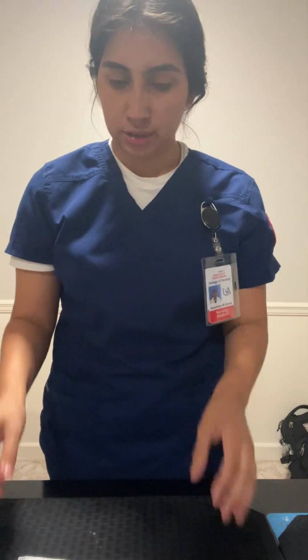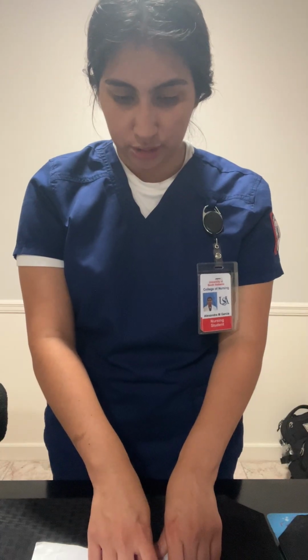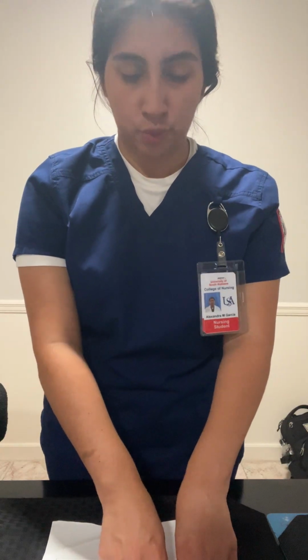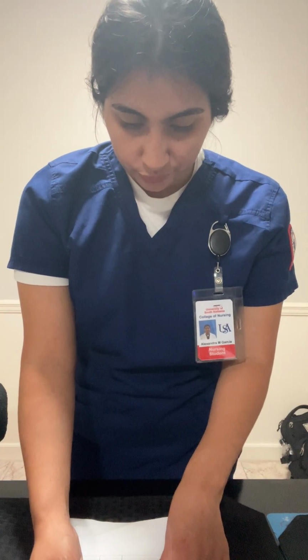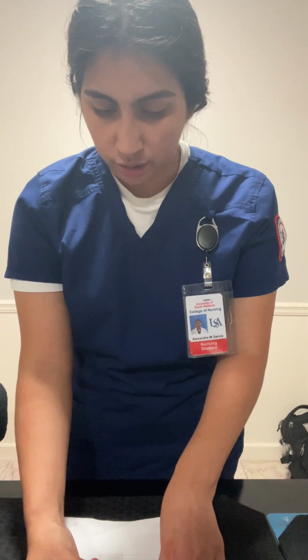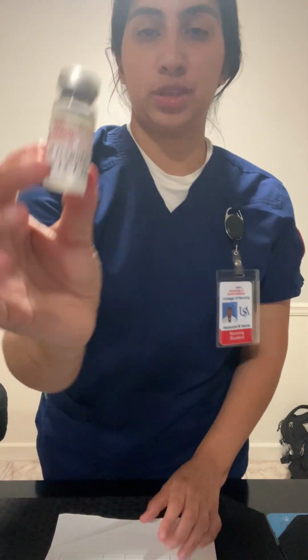Now I'm going to do my first check for my 7 rights of medication administration. First thing is right patient, Jaguar J. Jones. Then right medication, which is Novolin regular insulin, and I'm going to grab my vial and compare it to my MAR record. Novolin regular insulin, and I'm going to check the expiration on my vial, which is 12/1/28, and show it to the camera.